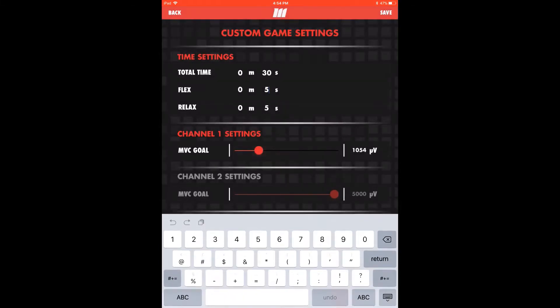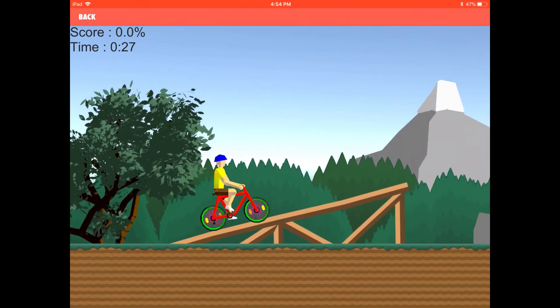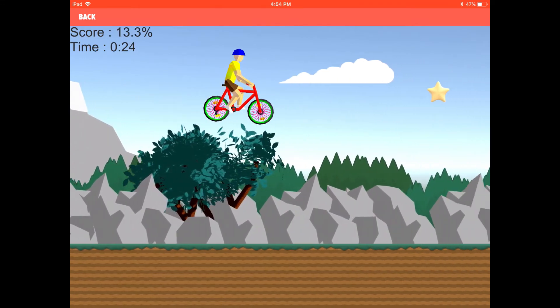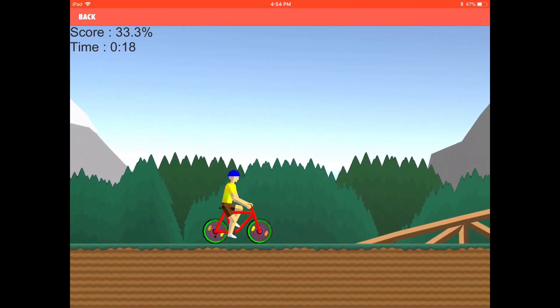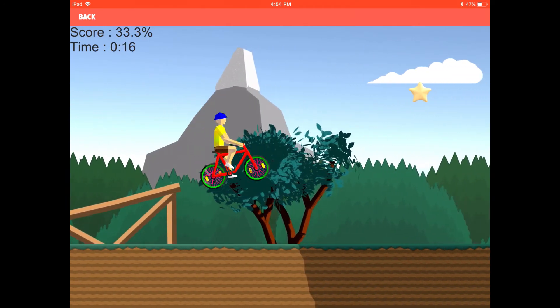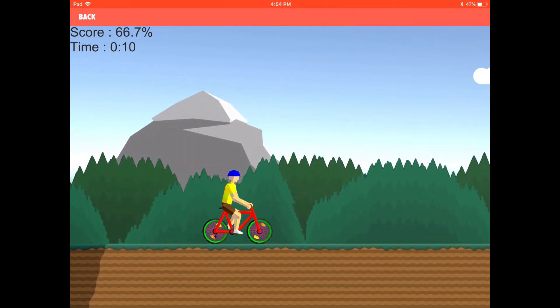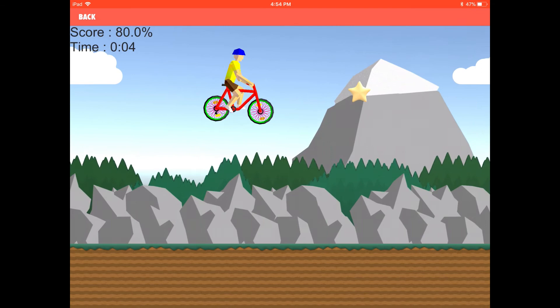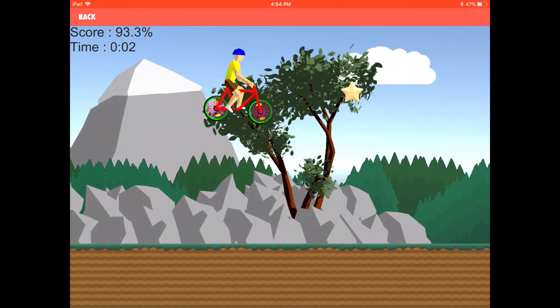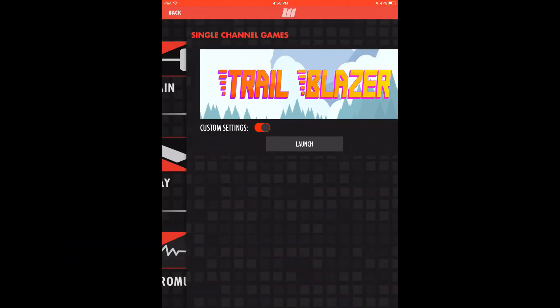Save settings and tap the back button to return to the launch screen. In this game, flex to launch the biker off the ramp and collect the stars. You'll see your score increase and your time decrease as you make your way along the trail. Tap back to return home.